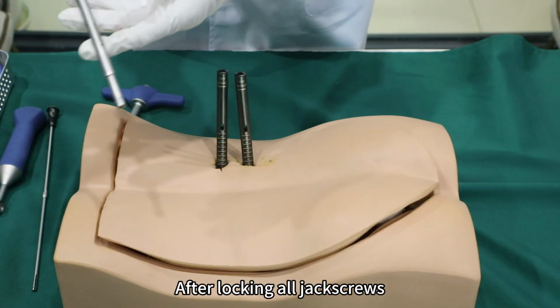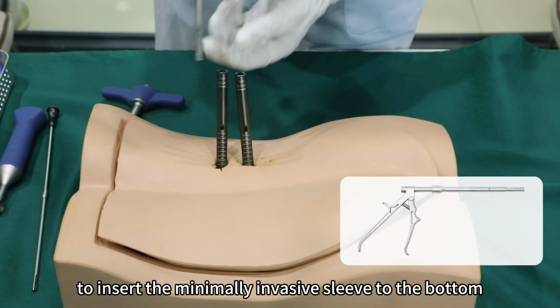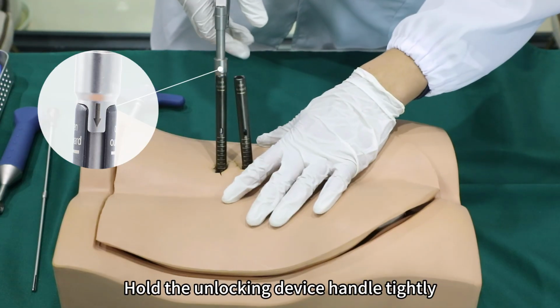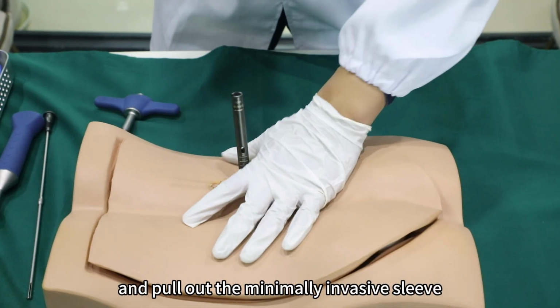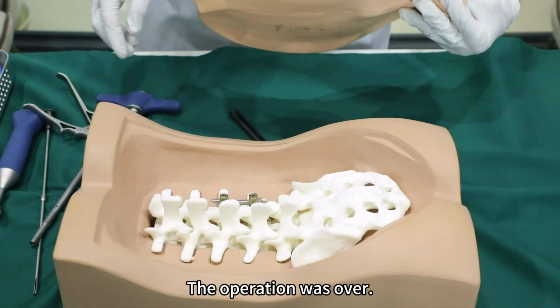After locking all jack screws, take out the minimally invasive sleeve. Use the minimally invasive sleeve unloader and insert it to the bottom of the minimally invasive sleeve. Hold the unlocking device handle tightly. Unlock the minimally invasive sleeve and pull out the minimally invasive sleeve in the direction of the outside. The incision on the skin surface was sutured. The operation was over.